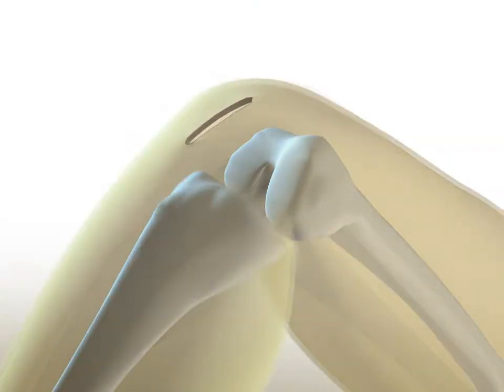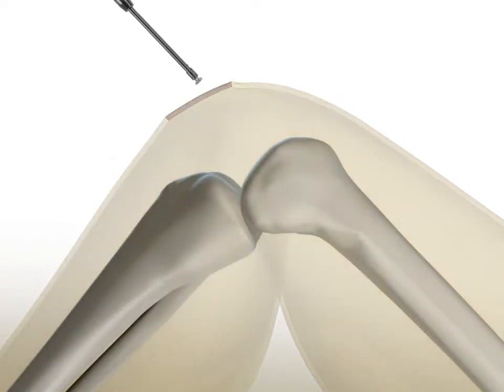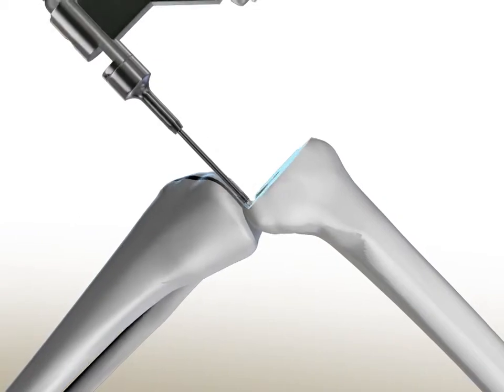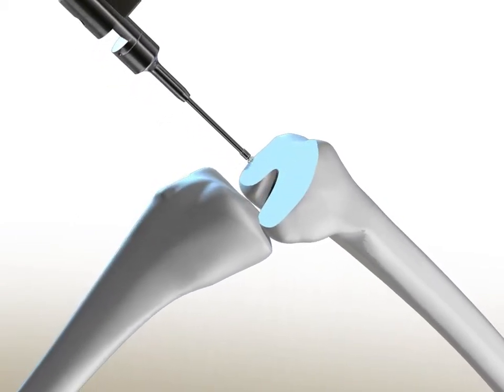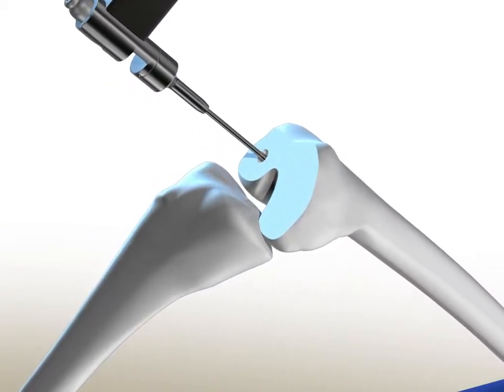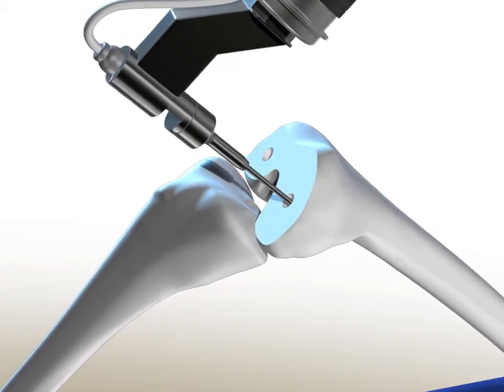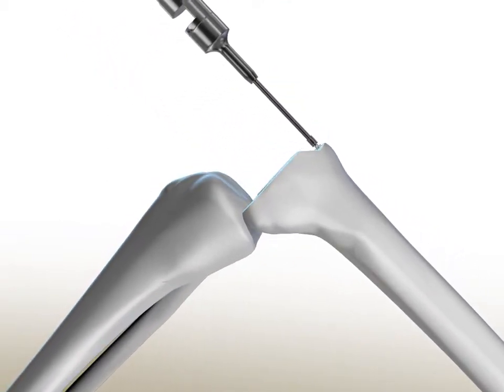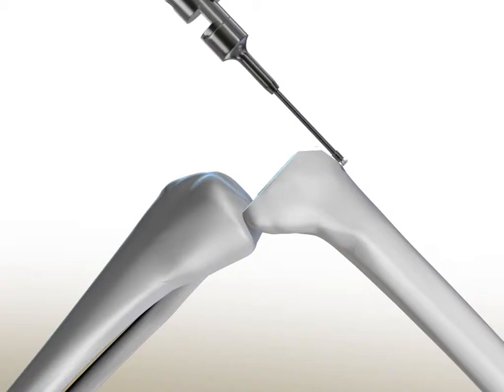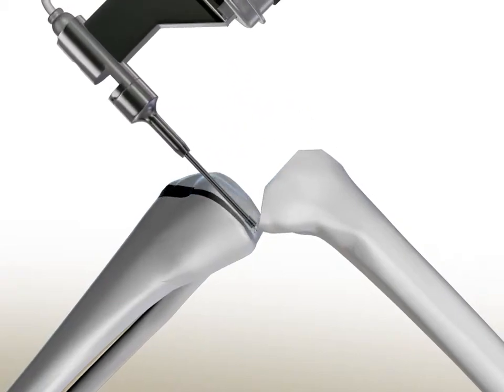The registration process enables the robot to match the preoperative plan to the patient's bone. Cutting is actually a gentle milling of the bone prior to implant insertion. This process is performed by RoboDoc, which precisely places and aligns the milled surfaces.